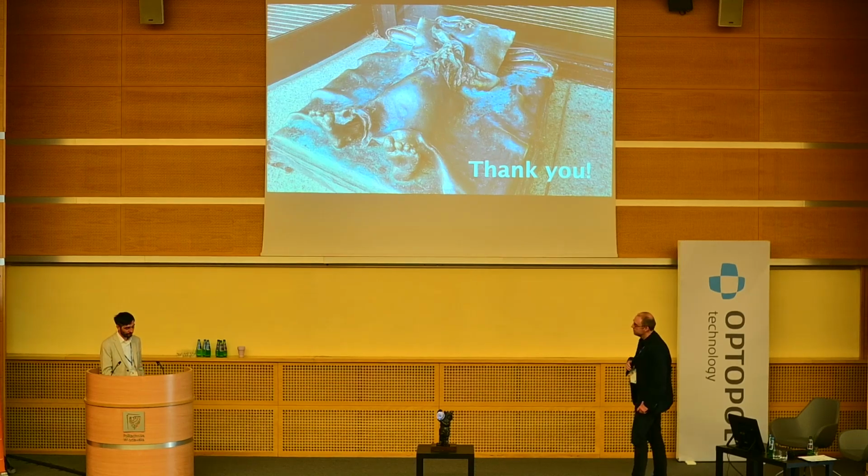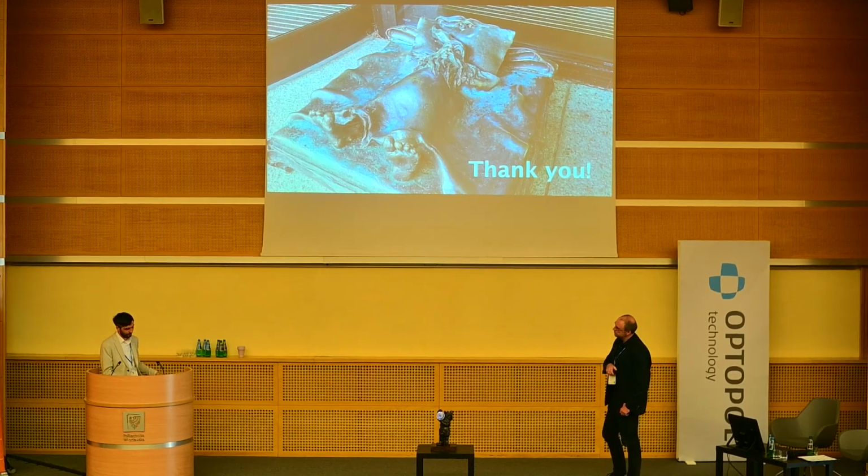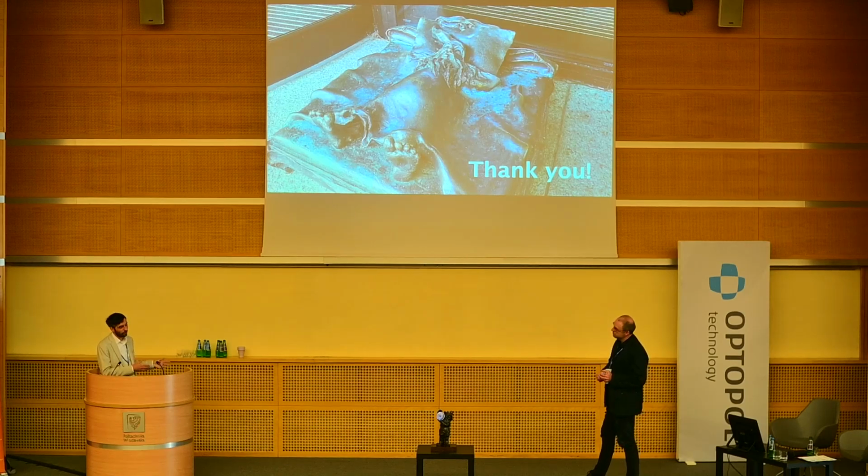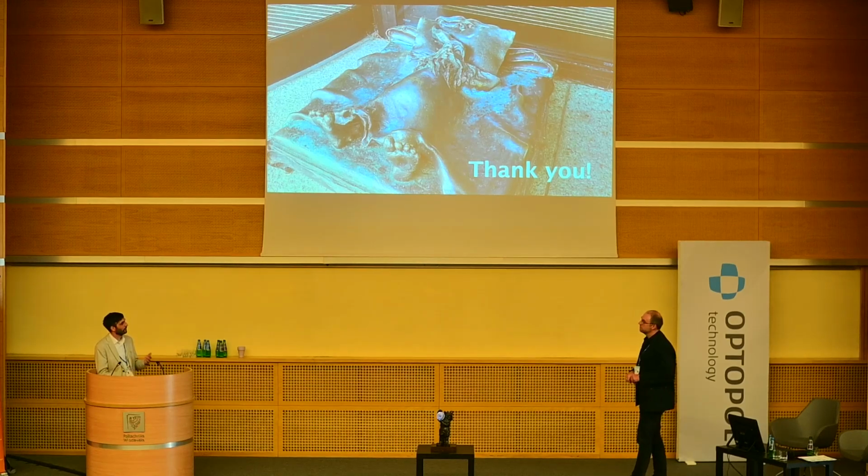So as I said, what's been used in the clinic so far is structural imaging and angiography imaging, which do not really require any changes to the optical setup. Polarization-sensitive OCT may also be useful, but it requires additional components in the setup, so it's not something that can be implemented in existing systems. Doppler OCT, on the other hand, is something that could be useful.